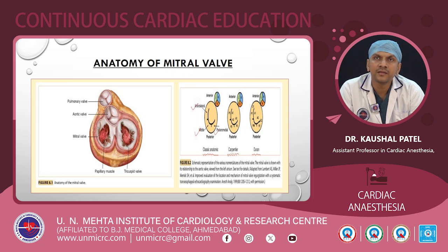In the posterior mitral leaflet, there are scallops. There are indentations present in the posterior mitral leaflet, which can be classified as P1, P2, and P3. Corresponding to P1, P2, P3, the anterior mitral leaflet is divided into A1, A2, and A3. The medial part at which the anterior and posterior mitral leaflets meet is called the medial commissure, and the same for the lateral commissure.